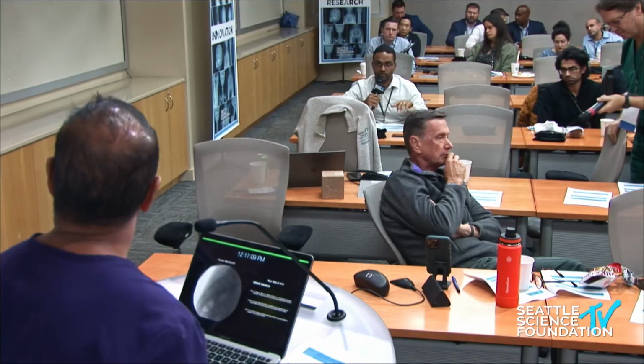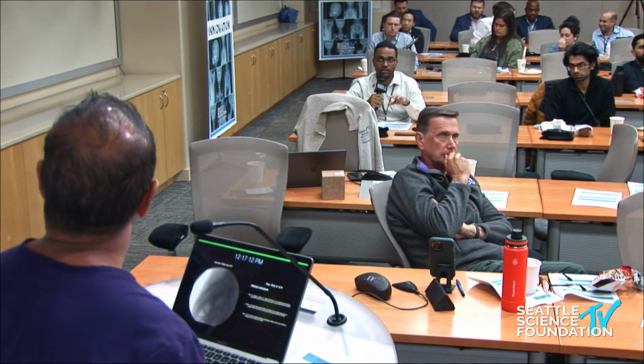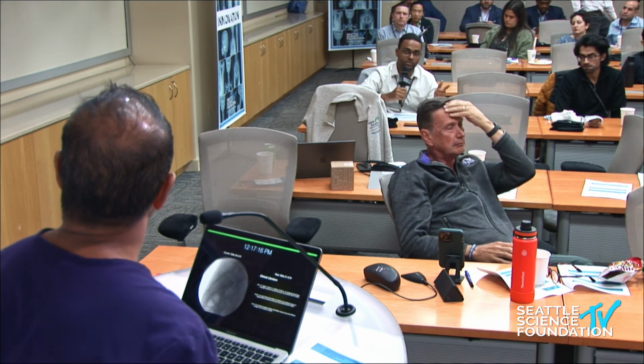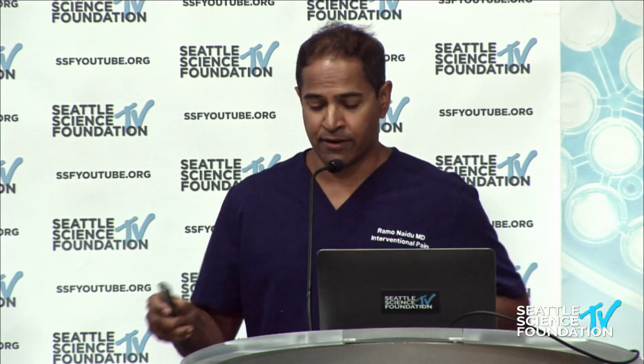So far, the indication for the dorsal column and the dorsal root ganglion stem. How do you suss out which patient is a good candidate for the dorsal root and not dorsal column? Well, there's a Venn diagram. They're not the same. You have a lot of different indications for dorsal column stimulation, quite frankly, based on our studies, including spinal stenosis, lumbar radiculopathy, post-laminectomy pain syndrome, i.e. failed back surgical syndrome, and then the sympathetically maintained conditions like you're mentioning, CRPS, causalgia.